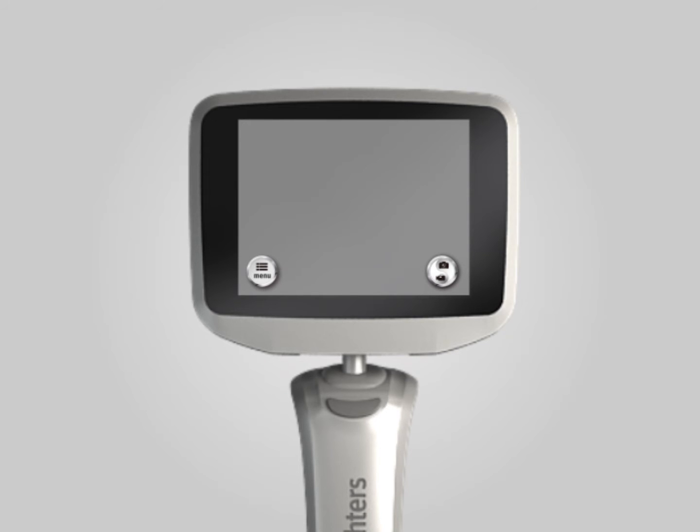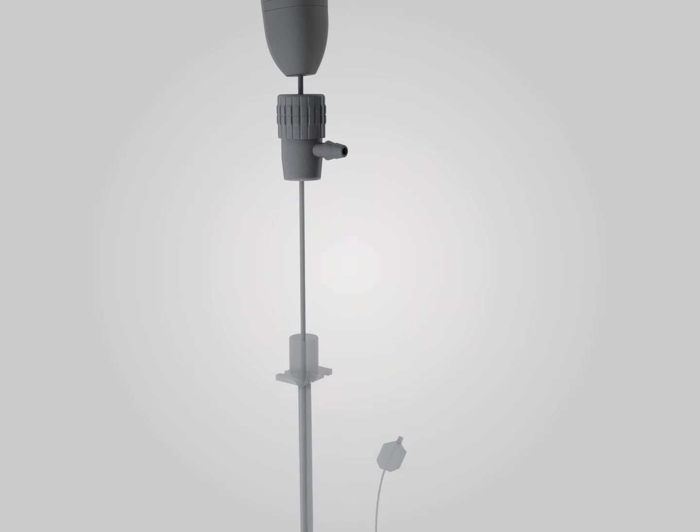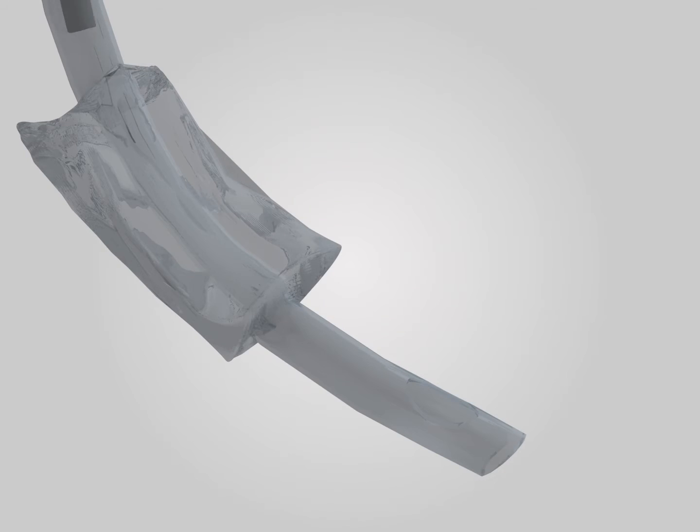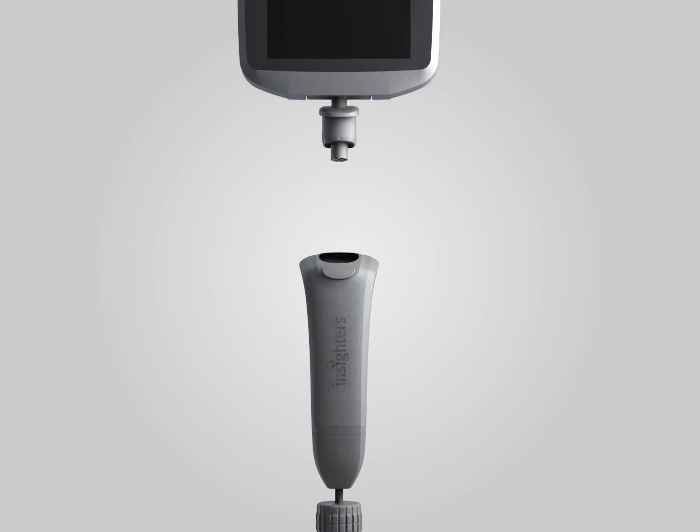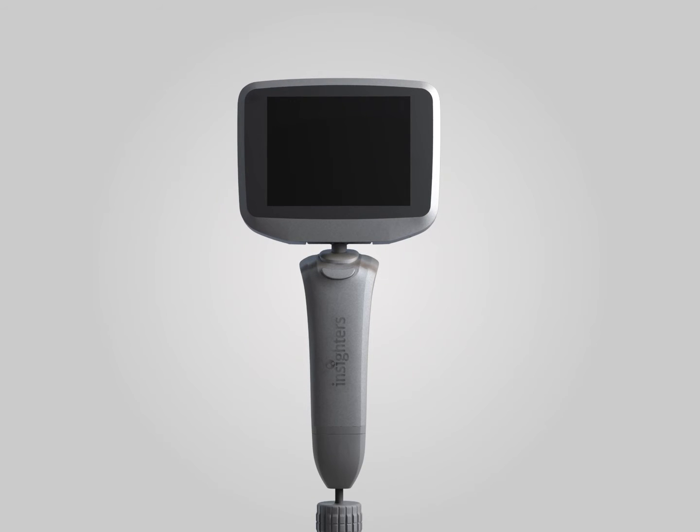Before intubation, please add a proper endotracheal tube to the retainer, which is on the tube core. Then adjust the position so the front end of the tube core remains inside the Murphy hole of the endotracheal tube. Please note that the retainer must be fastened after this.